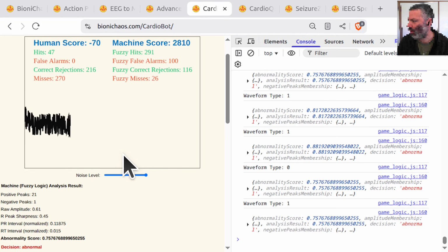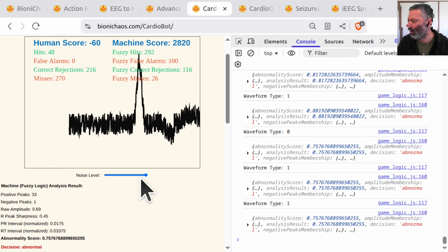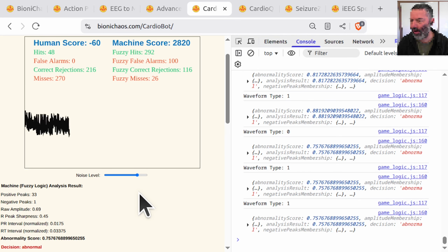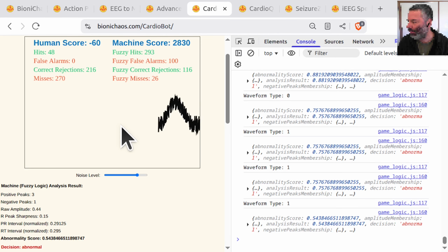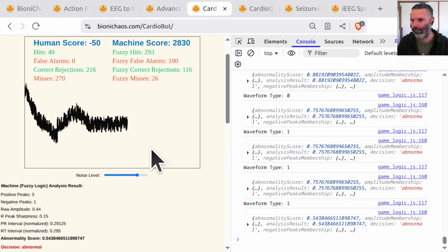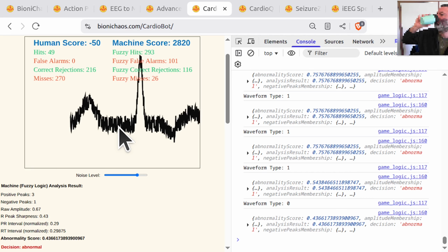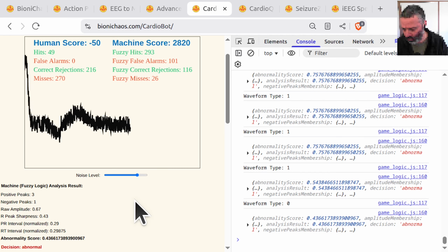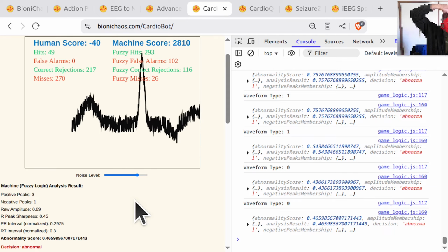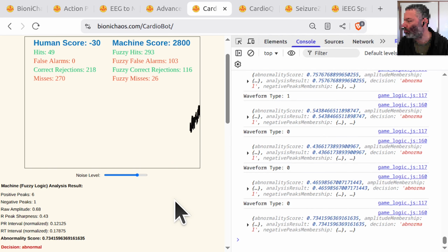The analysis happens instantly when the user clicks. Exactly! We eliminate the entire network dependency. Let's tackle the two main Python hurdles and detail the elegant JS solutions. The signal processing solution. The first challenge is replacing the heavy hitters, NumPy for array math and SciPy.signal for those custom peak detections, the positive, negative, and that clever R-peak sharpness calculation. Right. SciPy.signal.find_peaks is where the current system gets its muscle.